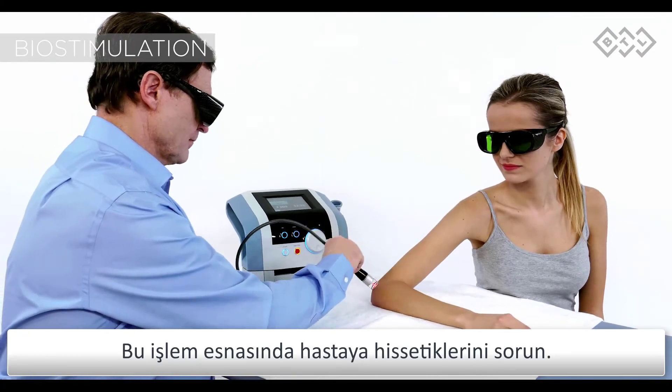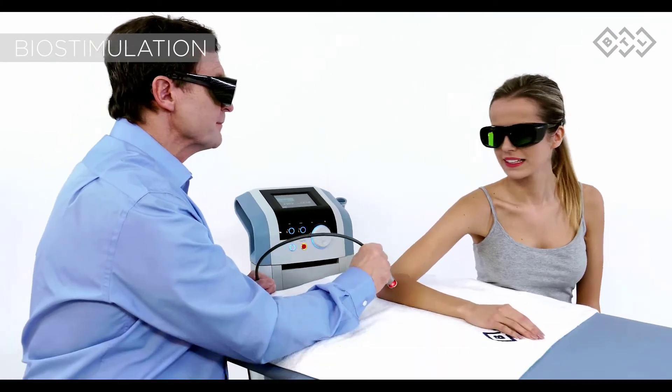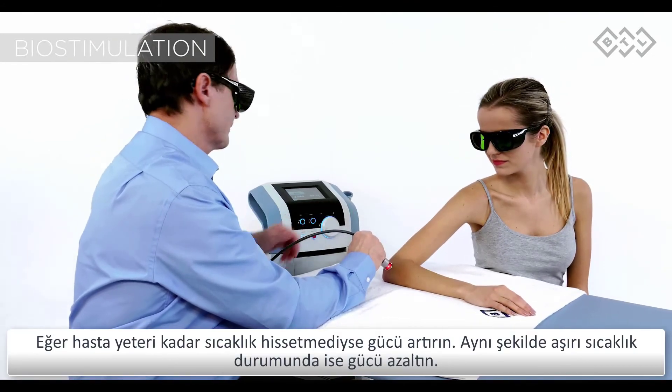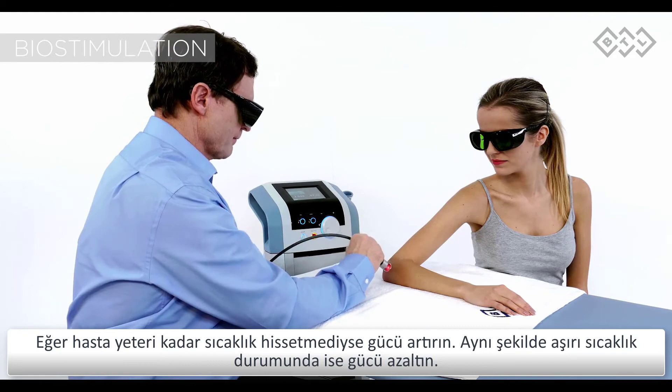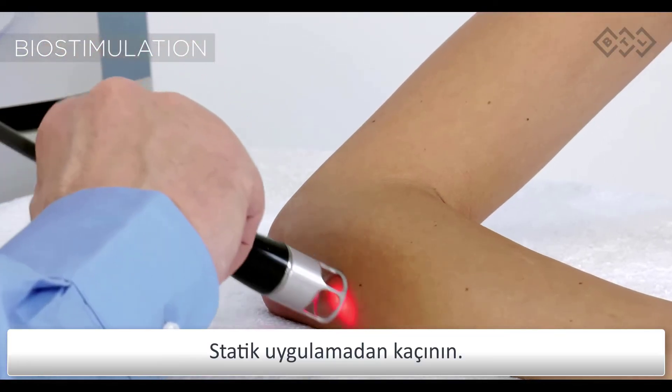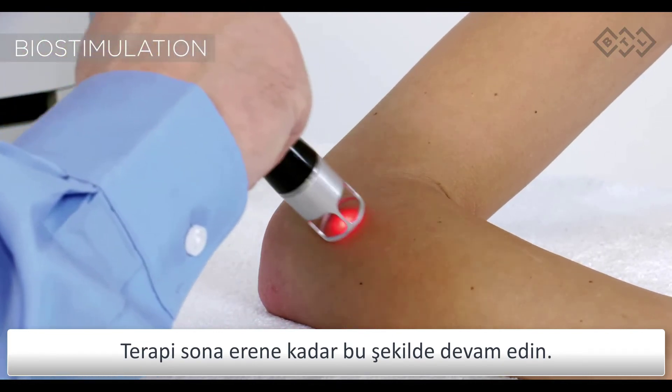Actively ask about the patient's feeling of warmth. If no warmth is felt, adjust the power to a higher value, or vice versa if the heat is too intense. Prevent static application. Continue until the therapy time is up.